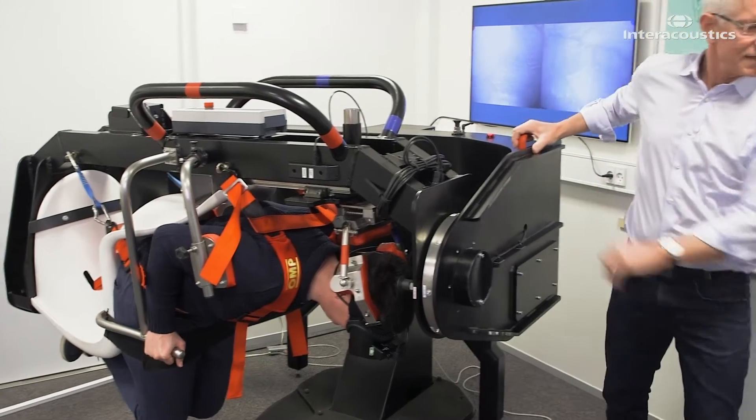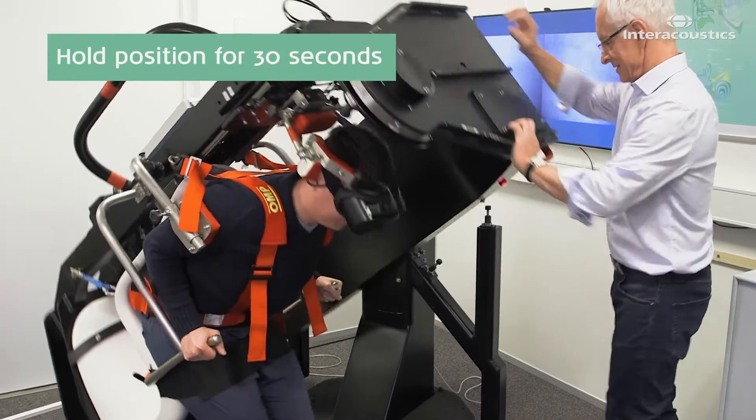Hold the patient in the final position for 30 seconds before returning to the upright position.